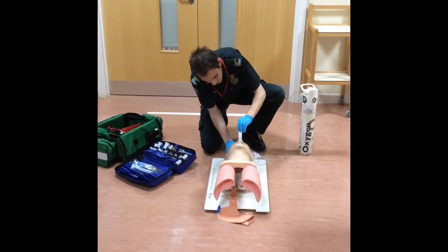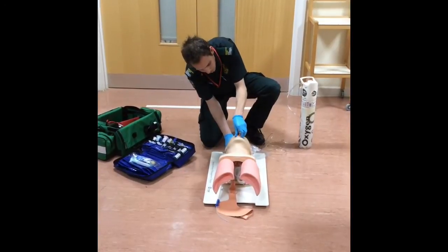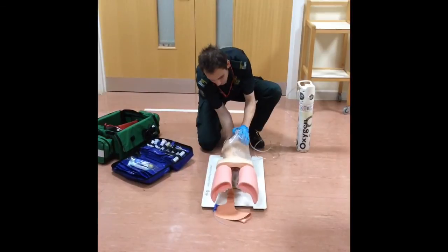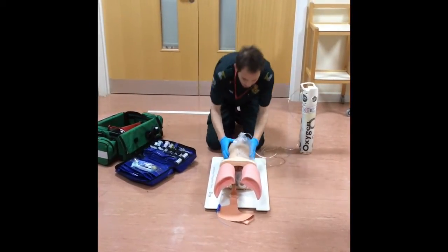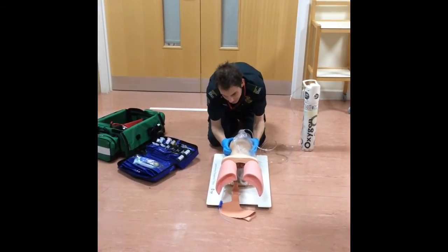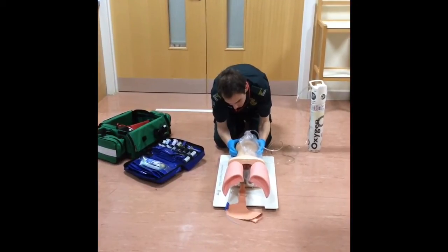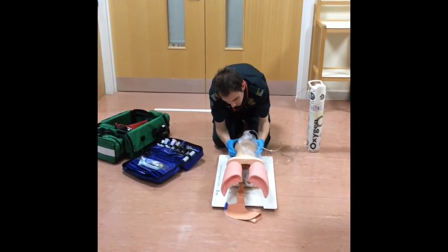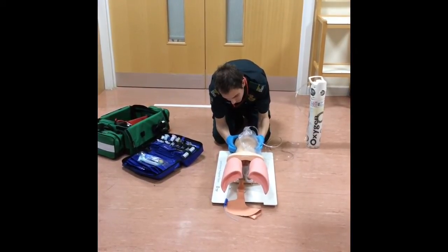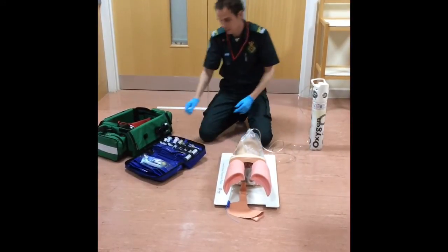The airway is clear, mouth is clear, so insert the airway upside down, advance, rotate and advance again. Mask back on, and this time I'm going to do a bit of a jaw thrust to see if that helps. Again, considering ventilating the patient, but they're making effort, about 6 to 8 a minute, so I'm going to leave that at the moment. So I do that. Okay, patient's still snoring. So I'm going to advance this up again to an i-gel. So I'm going to leave all of that in position in case it is doing some good.